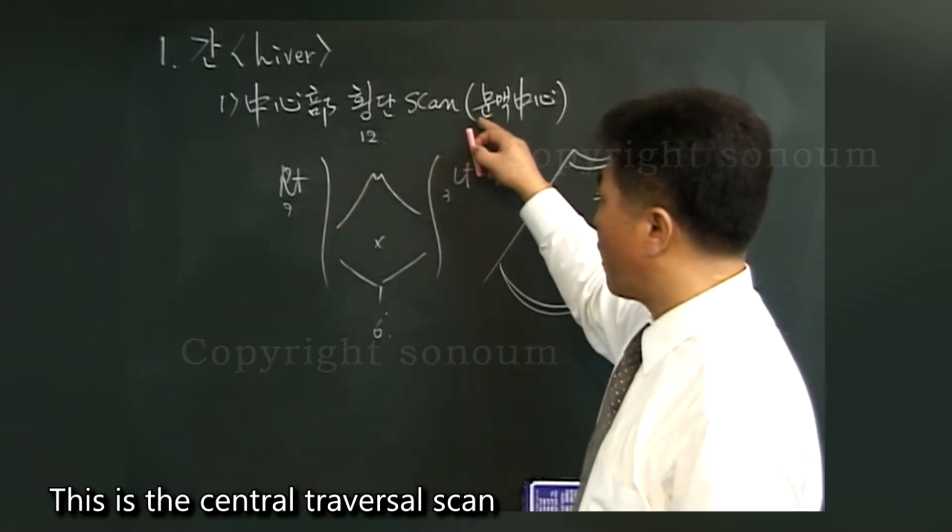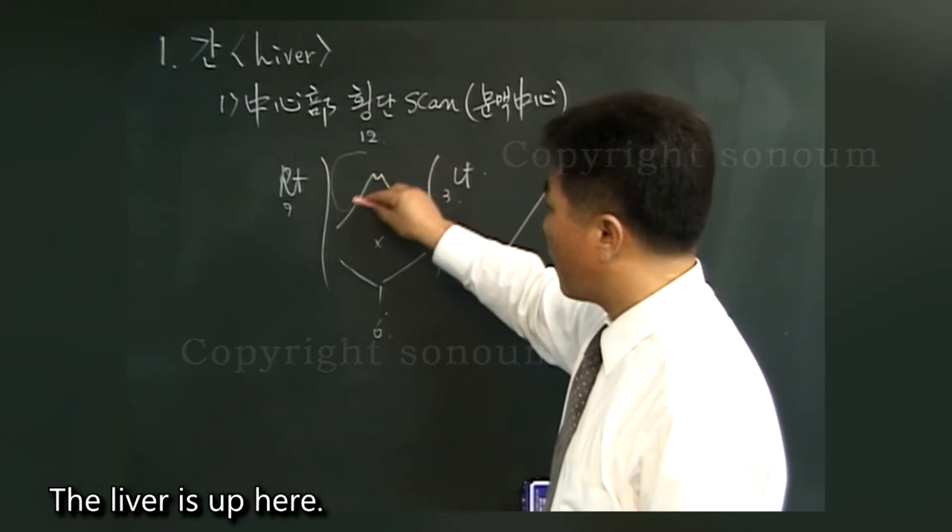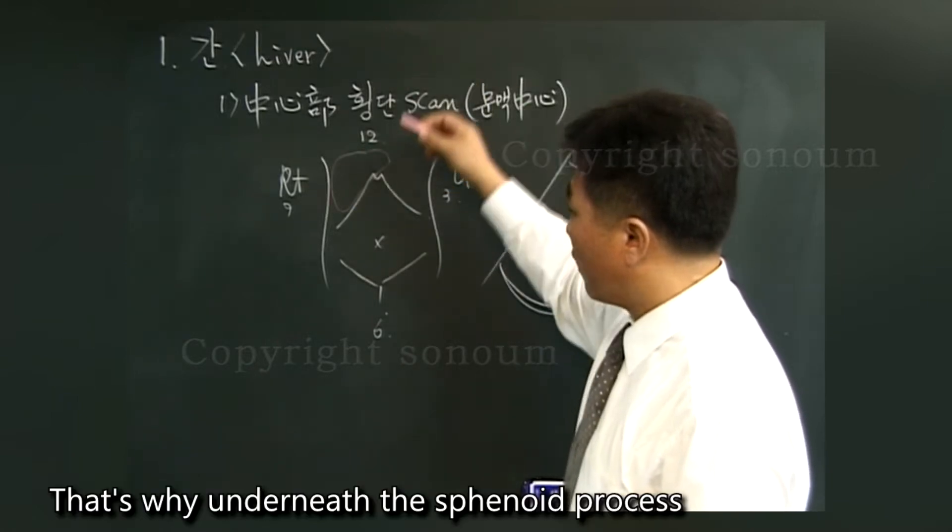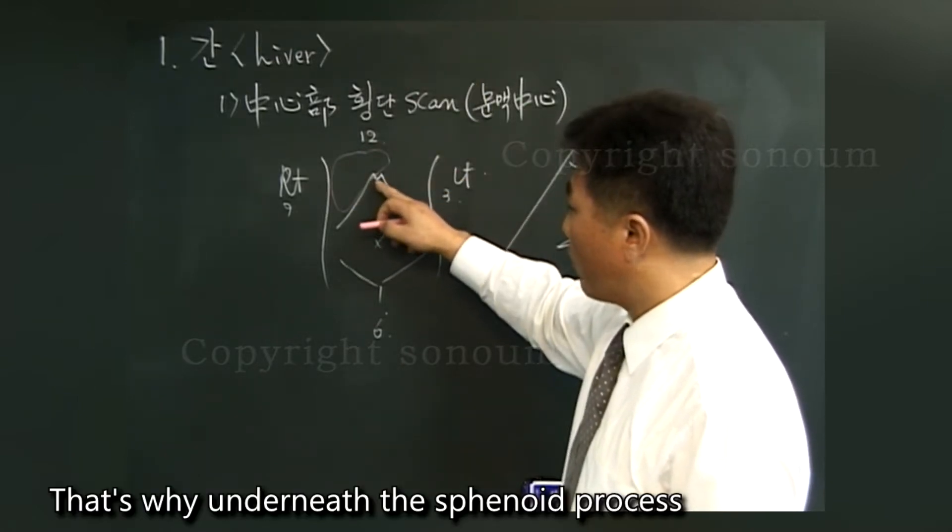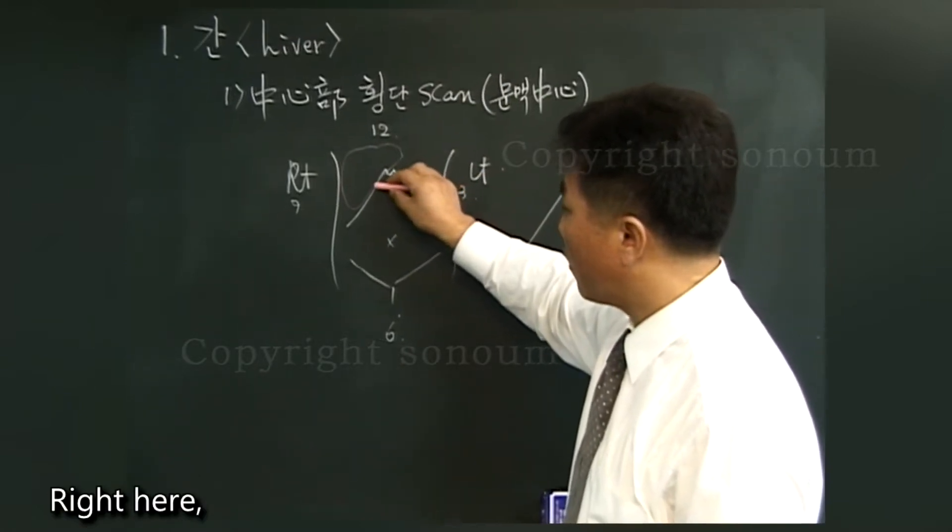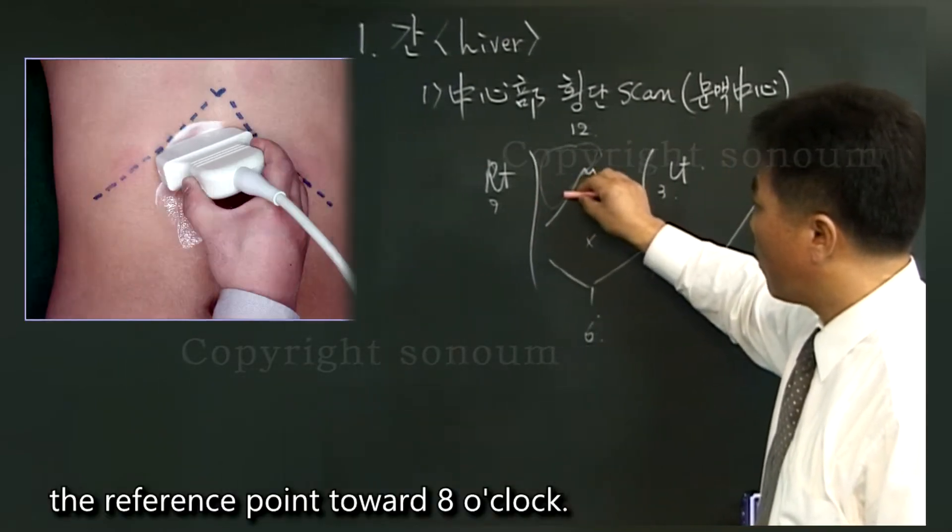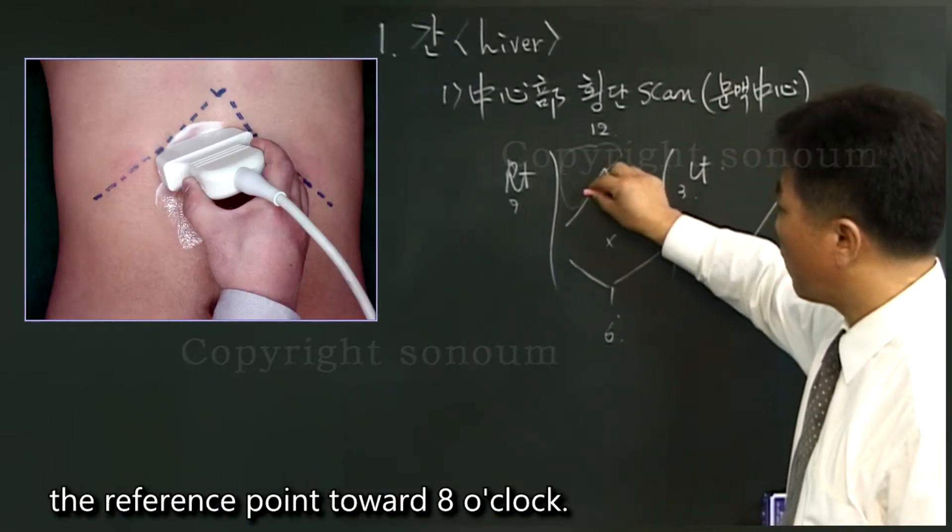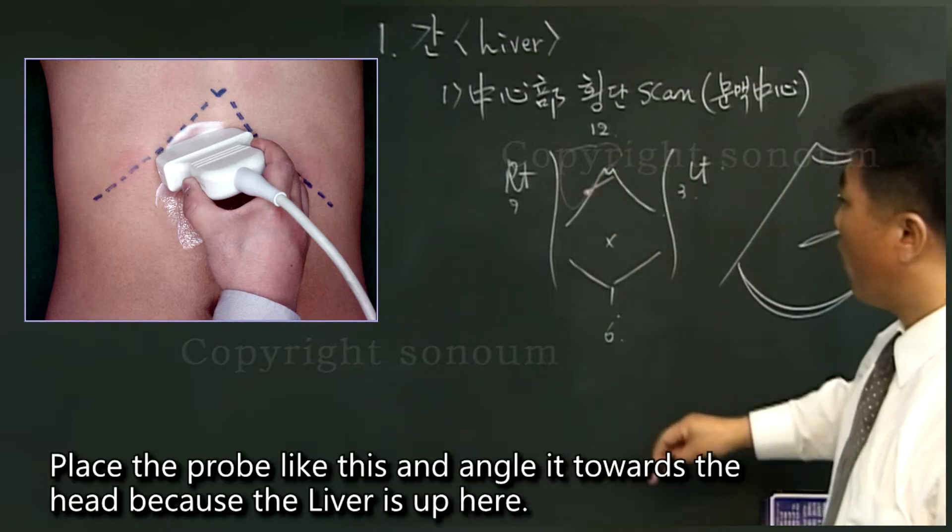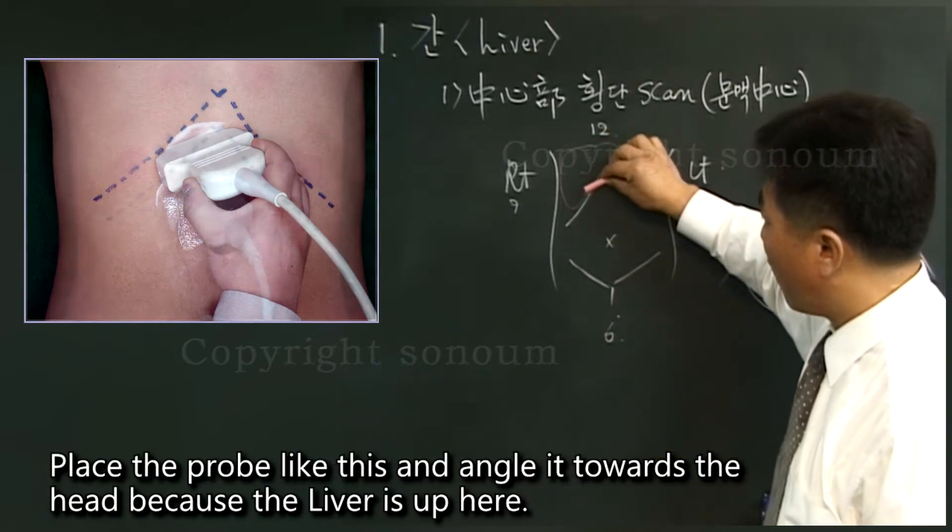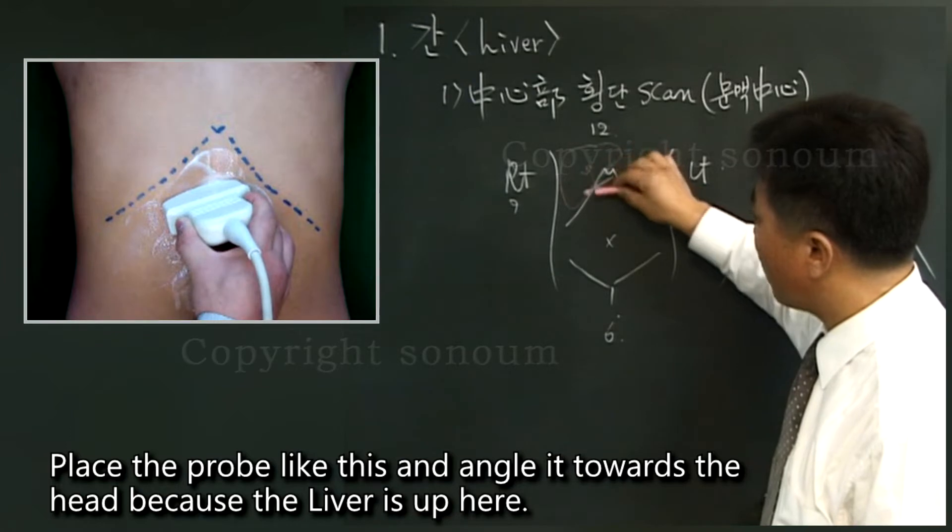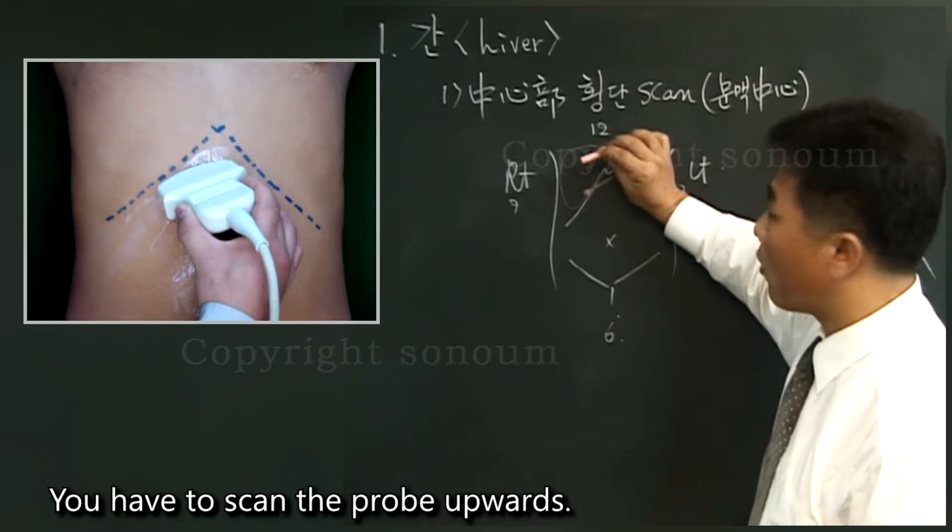This is the central transverse scan. The liver is up here. That's why underneath the xiphoid process, right here, the reference point toward 8 o'clock. Place the probe like this and angle it towards the head, because the liver is up here. You have to scan the probe upwards.